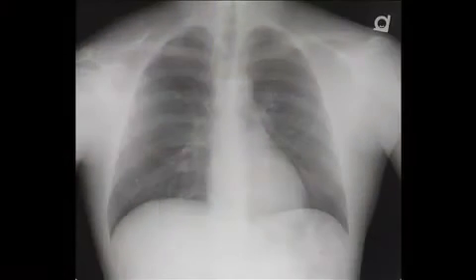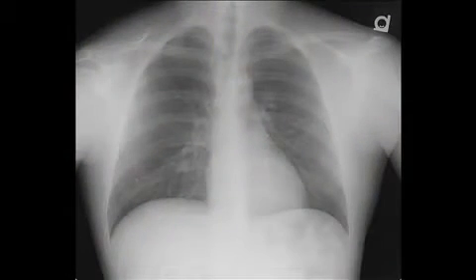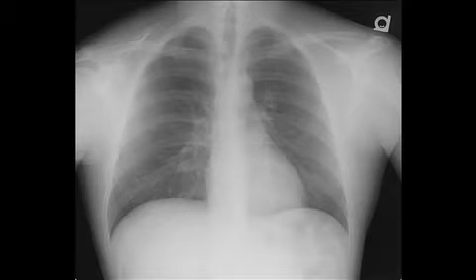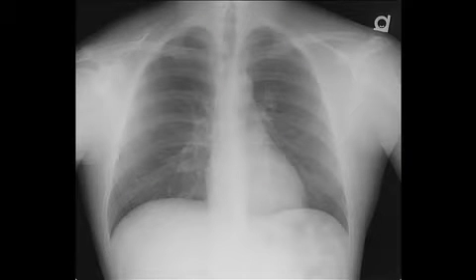This is a chest x-ray from the same patient just before the ultrasound was performed. Even on close inspection, there is no evidence of the rib fracture.